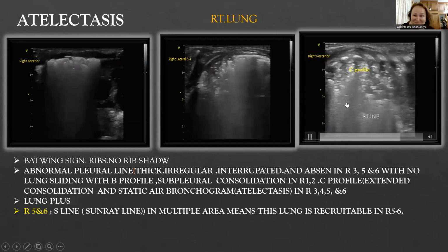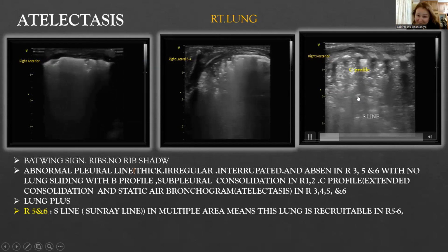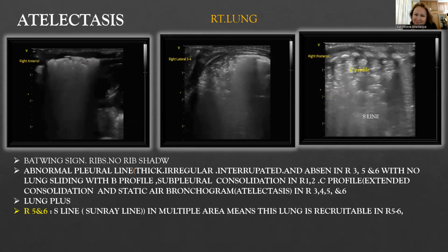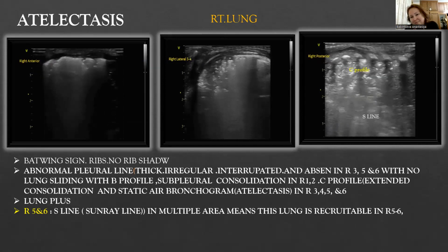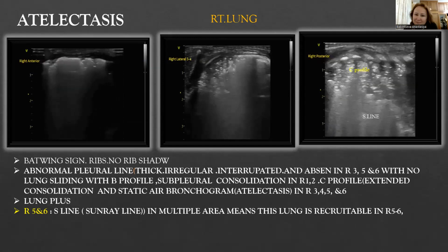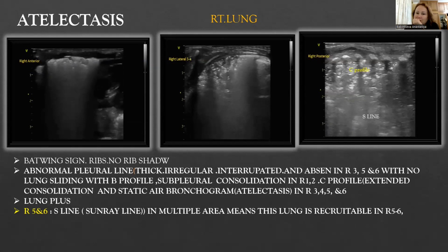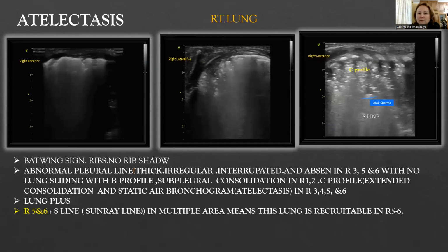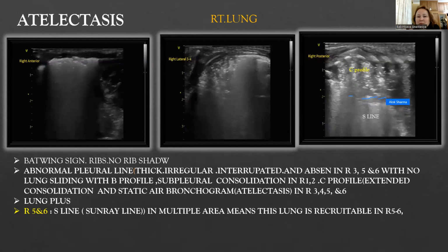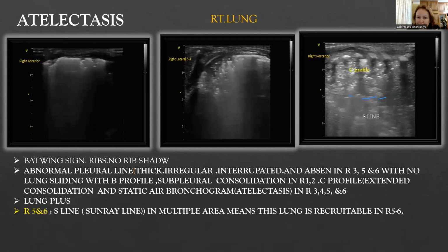Can you see the linear pattern that comes through? Those linear patterns that you see, Dr. Babin Seva, and I've got another image that I'll share with you, are like the rays of a sun. If you look at my fingers, they're going in and out like that, so they tend to be horizontal. If I draw it out for the exact areas, can you see this area here, this area here, this area here? They're like the rays of a sun.